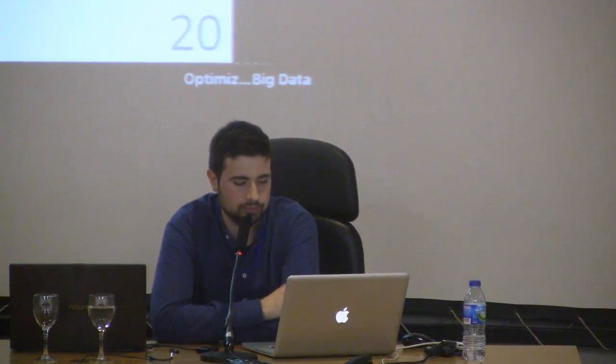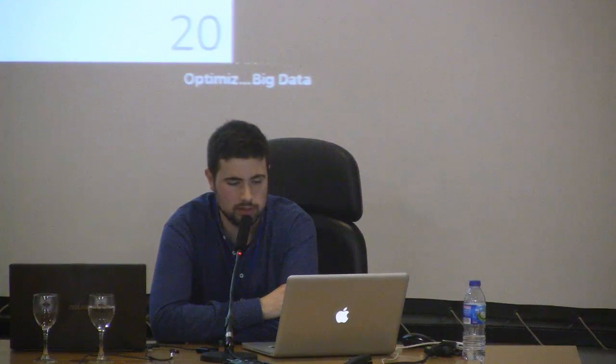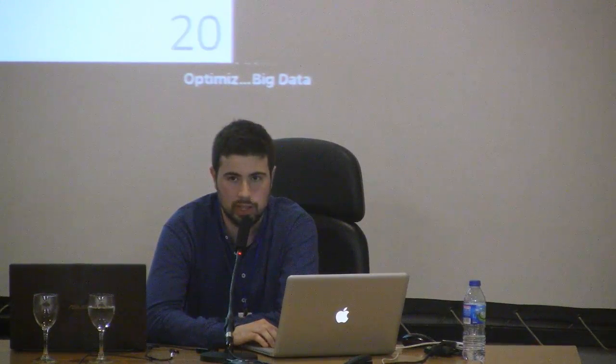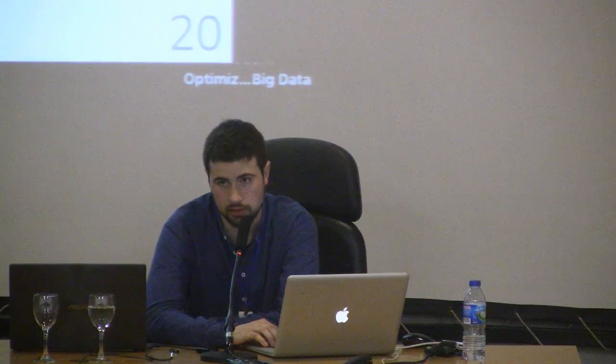So in a nutshell, your tool will receive a T1. You will have to implement a tool inside a Docker image, which I will explain how to do later. And this will produce a text file with two fields: the age and an optional letter code, which will be NH for non-healthy if you detect Alzheimer's, or H for healthy.